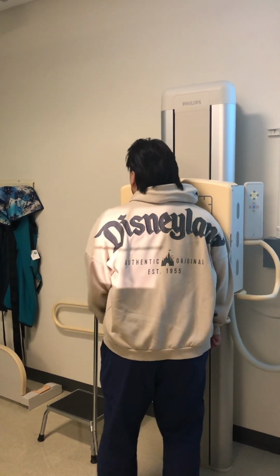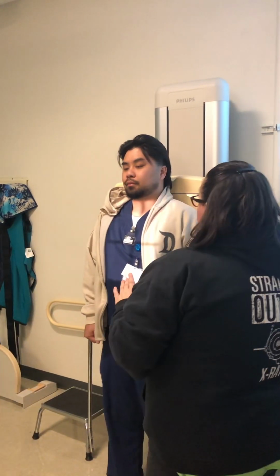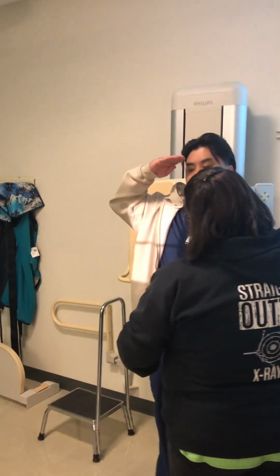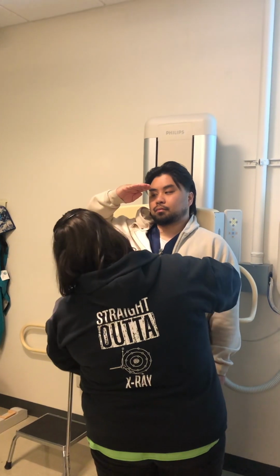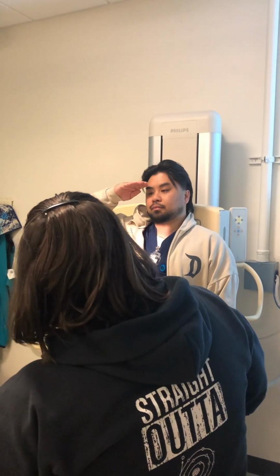Relax and turn around and put your back up against the board. Let's start with the right because that's how we get used to it. Step a bit back to your right. Bit more. Again, making sure there's no rotation, especially when they start lifting things. Make sure that they don't wiggle. Deep breath in and hold it.